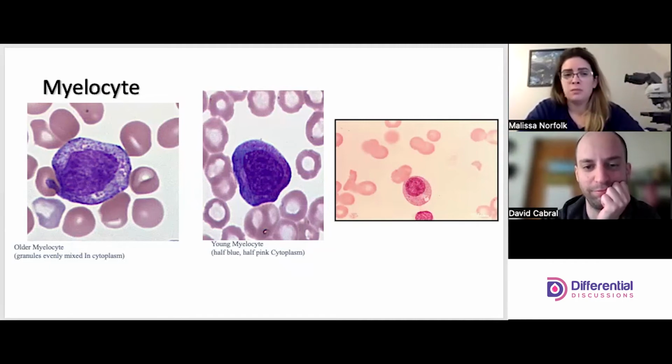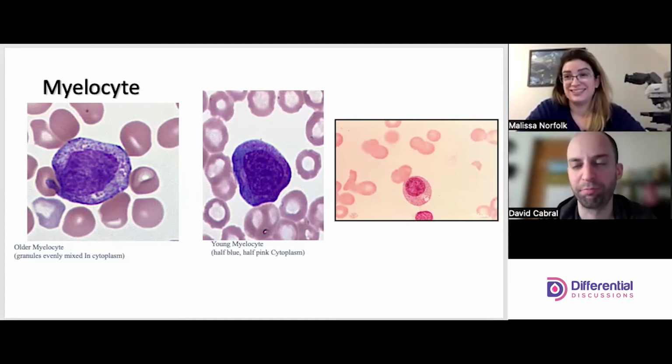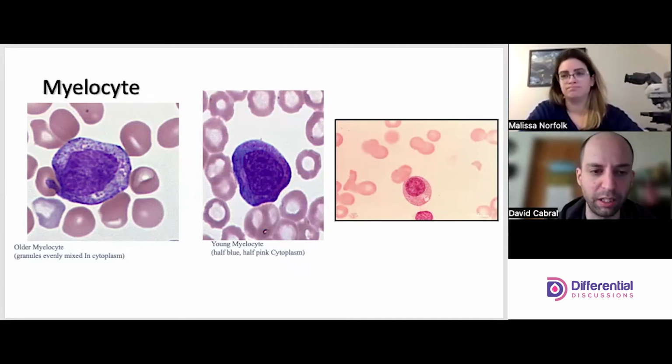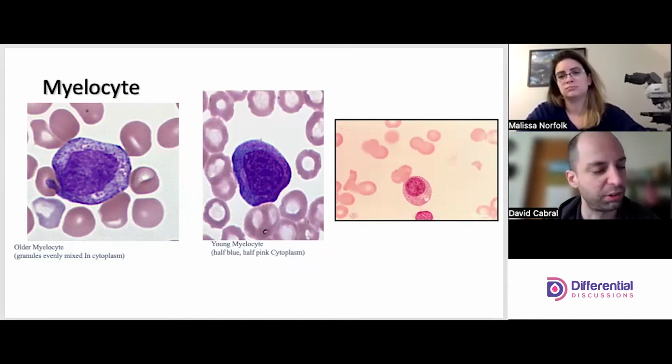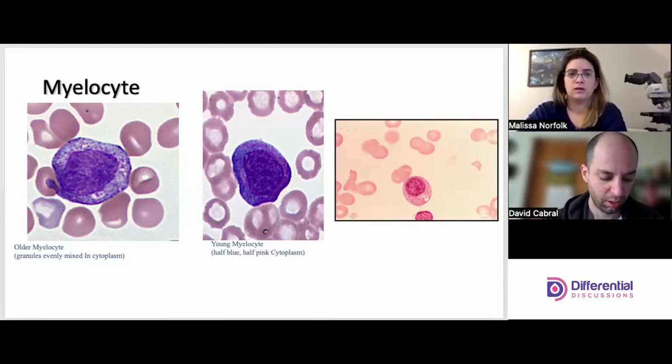I think it's also important to say that you may not see a Golgi apparatus, especially when you're looking at malignant cells. Malignancy really does throw a lot of the rules out the window, so you've got to be a bit adaptive there. And in truth, in my mind, spotting that there's a malignancy is the most important thing. Sometimes we get lost in the weeds of categorizing a cell or two here or there. But malignancy really throws a wrench in the formula for how these cells should appear. But we roll with it.